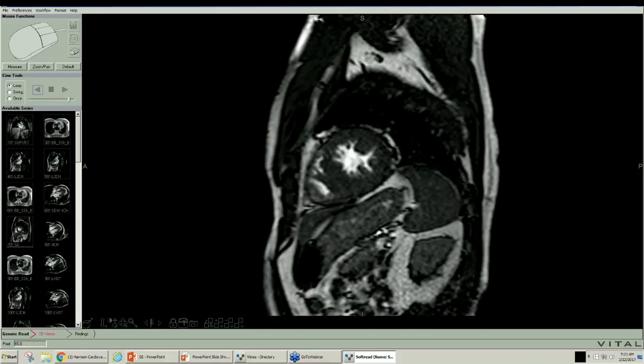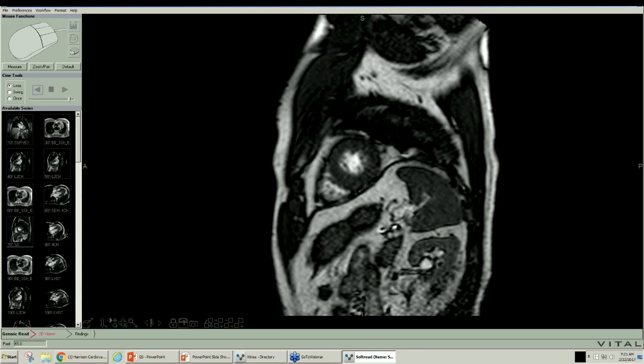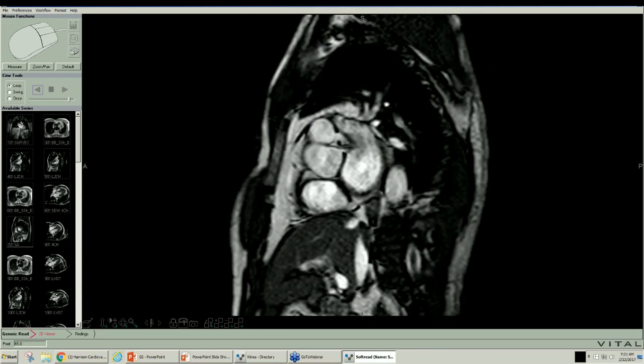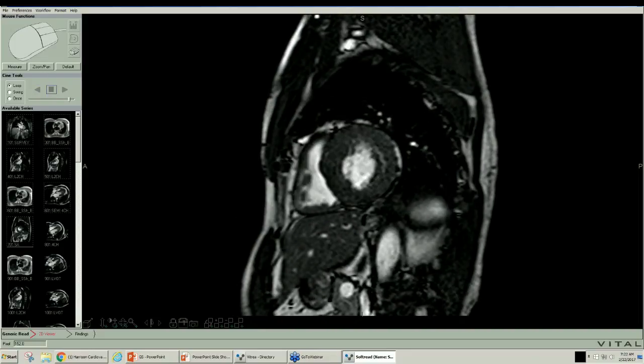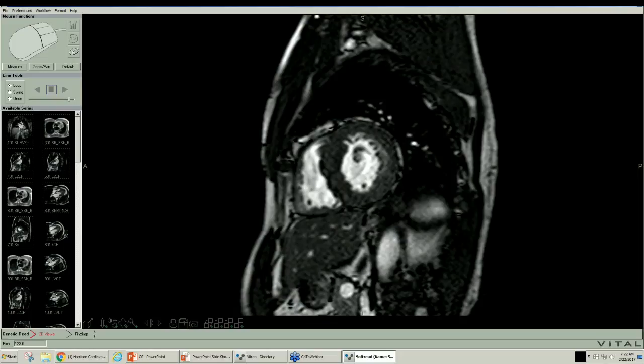throughout the left ventricle. Right ventricle might be a little thick over here. It should just be a couple millimeters in thickness. And so during diastole, the right ventricle is not just a couple millimeters. So the right ventricle appears to me to actually be thickened over here. If you want to do an average of that, you'll get about, oh, maybe 4.5, 5, which is abnormal. So you've seen the stack from which we calculate the ejection fraction.